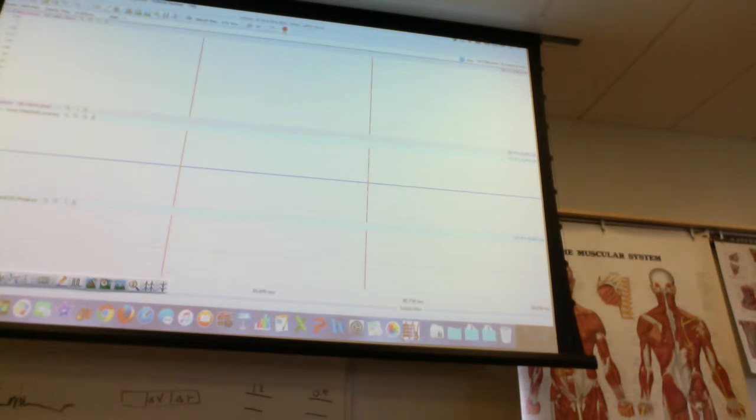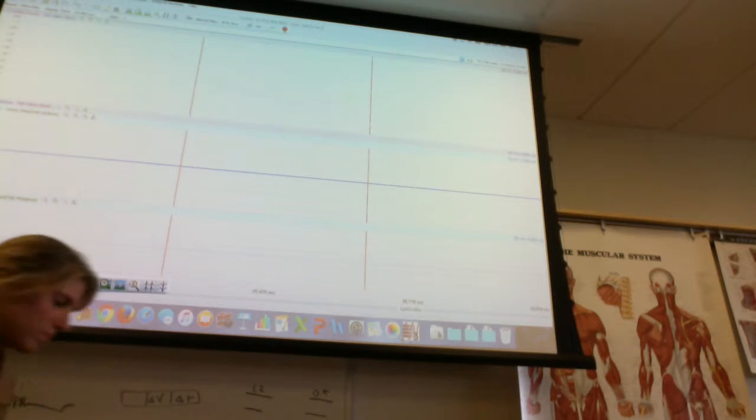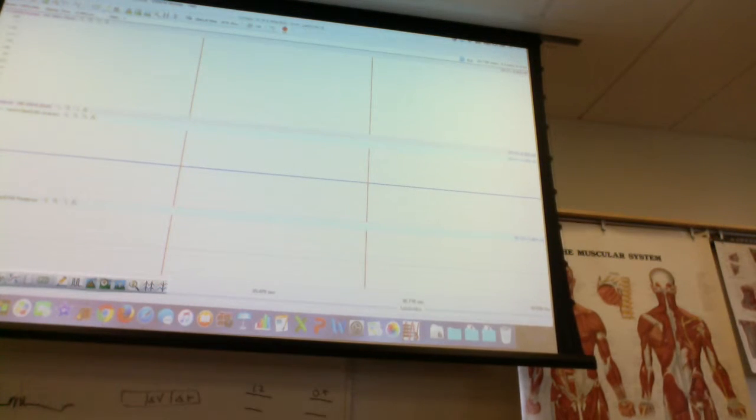Okay, so what you're gonna see, as in each one of these stations, there's a recording unit. This little box can receive a lot of different information from various inputs. In this particular case, we're going to be hooking up through this. Right? These are some electric wires. It can't shock you, so don't be afraid of that. It's just going to record the EMGs and then transfer that to a graphical representation on the screen.